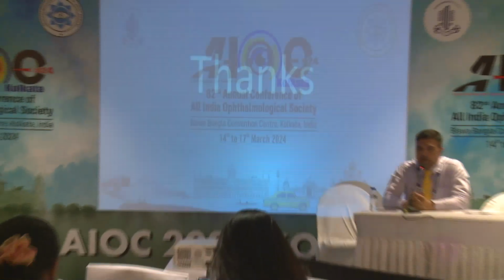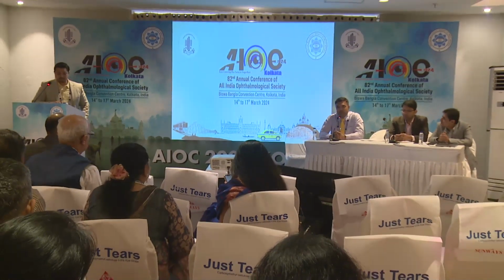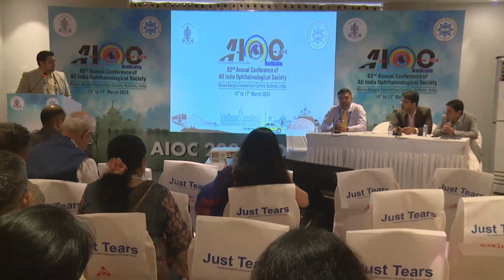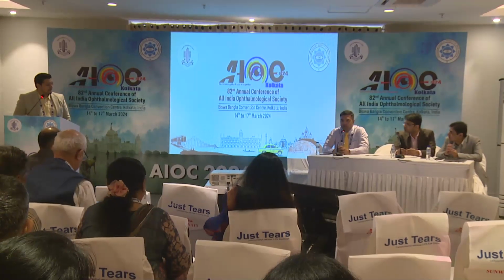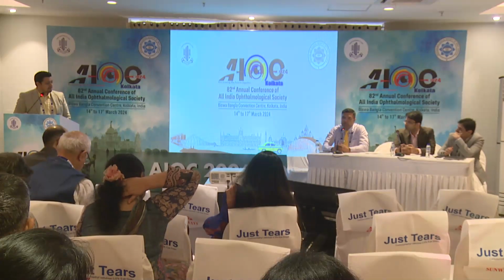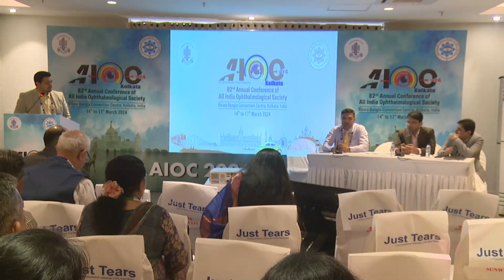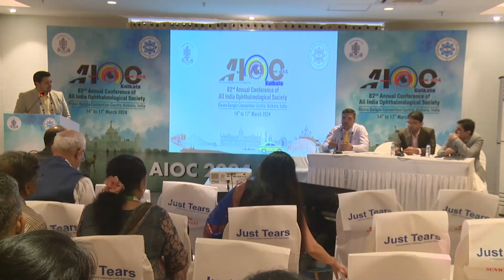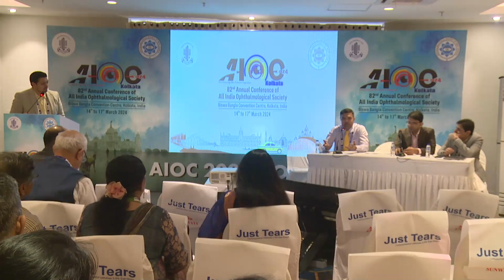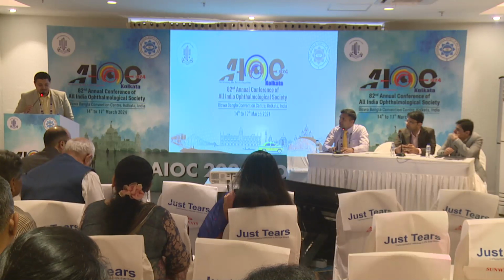Excellent presentation, Ankur, and I would like to emphasize one fact: where one finds a very good usage of OCT angiography is in a burnt out choroiditis disease where you have a lot of atrophy. When you try to do an FA or ICGA, you have leak almost everywhere. You're not able to see your flow void areas. But on OCTA, since you do not have overlapping hyperfluorescence like FA, you are able to appreciate these flow void areas of the choroid much better and follow these patients with the treatment. Any comments, Ankur, on this?